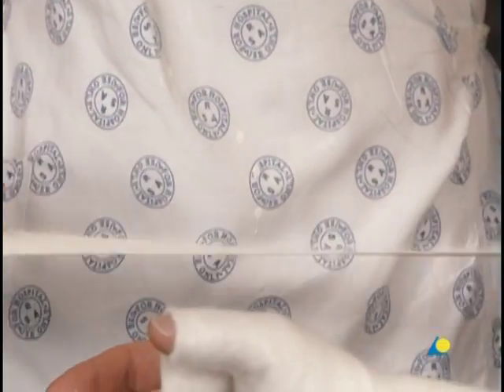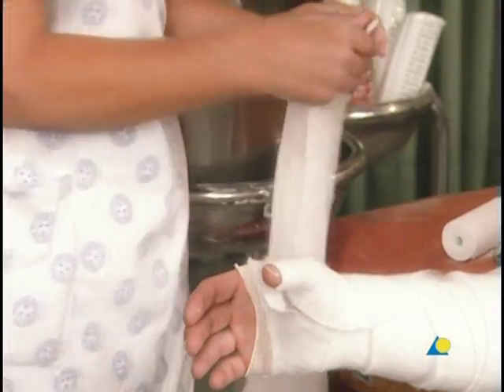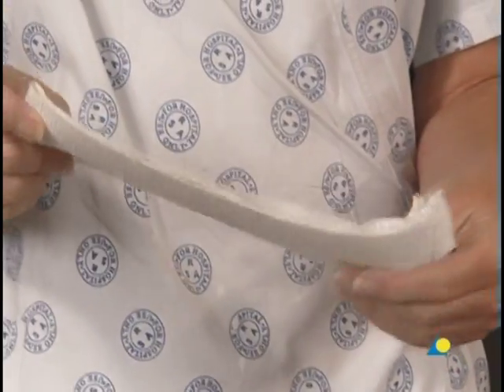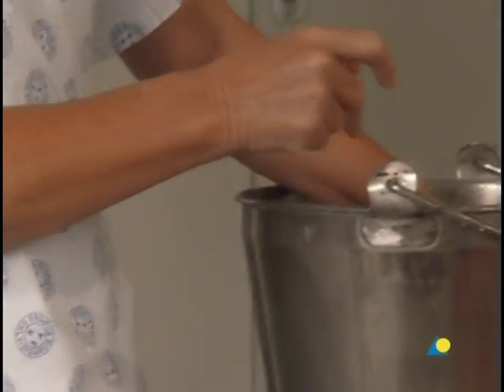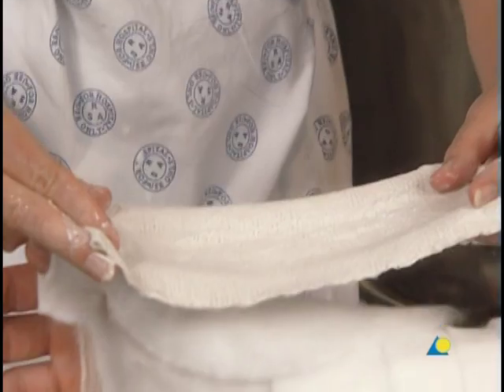A length of plaster bandage is torn off and folded over to form a slab. The slab is wetted and placed over and around the thumb.